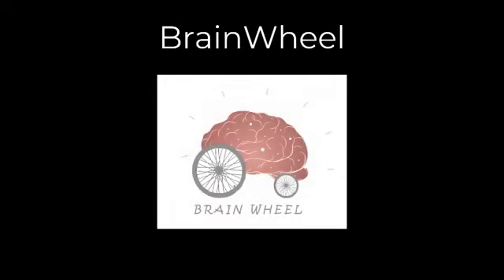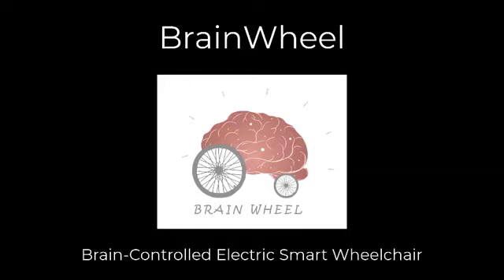In this video, we present a short demo showing our project BrainWheel, a brain-controlled electric smart wheelchair. BrainWheel has two modes, a manual mode and an autonomous one. We will be showing both in this demo. BrainWheel also possesses some features to maintain users' safety.